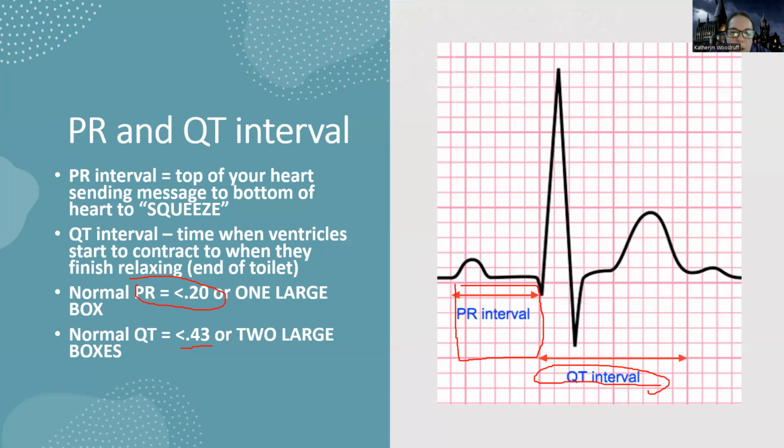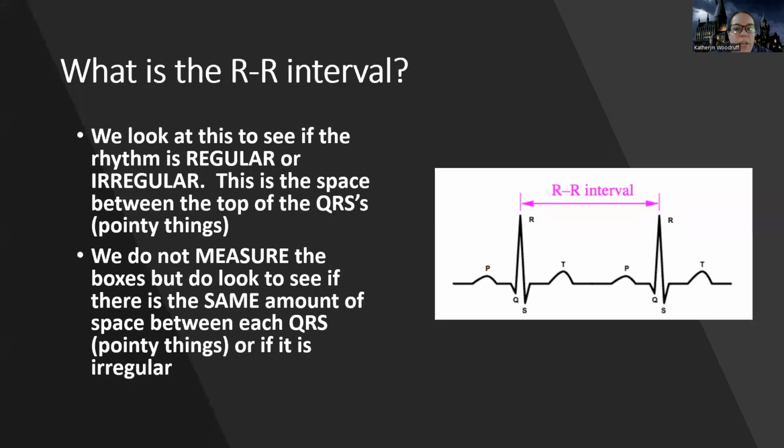Again, you're not going to have to measure these for this class, so you can put your inhaler down and breathe again. But it's just good for you to start to look at this and see, okay, this is telling me about time, this is about how long this is supposed to be, and start looking at what's normal and what's abnormal. One last thing that we're going to look at is the R-R interval.